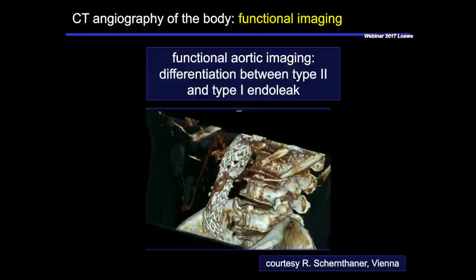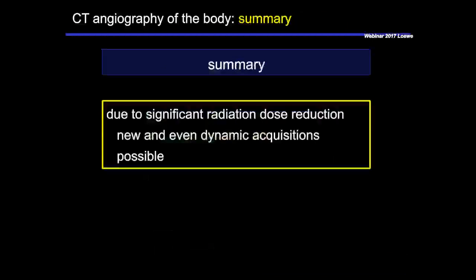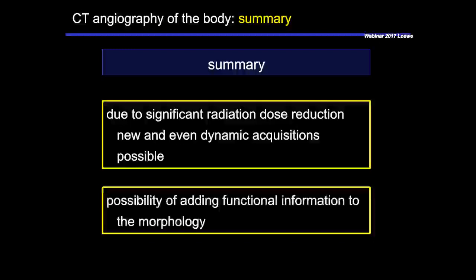Just to give you an insight: due to the significant radiation dose reduction, new and even dynamic acquisitions will become possible, and this will provide the possibility of adding functional information to the morphology. That's a totally new field, and that's really interesting, and the role of radiology and CT angiography will really increase thanks to those new possibilities in the very close future.